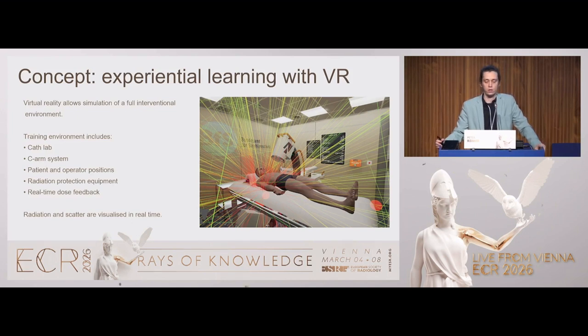Basically, you can see here a screenshot from our application. It's a virtual IR room, like a cath lab. You have a C-arm, you have a patient, you can move around in it freely. I will show you in the live demo shortly.